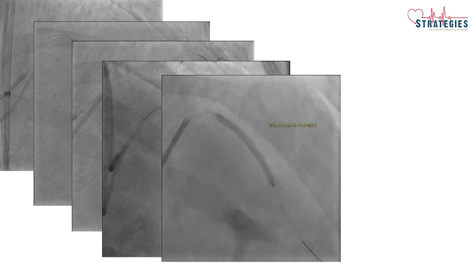At this juncture, we took a check angiogram and analyzed, which showed a clear collateral from distal diagonal into the proximal diagonal. As this diagonal was filling from the distal diagonal as well as from RCA with almost a TIMI 3 flow, we thought we would avoid bifurcation.